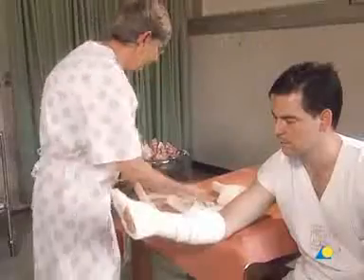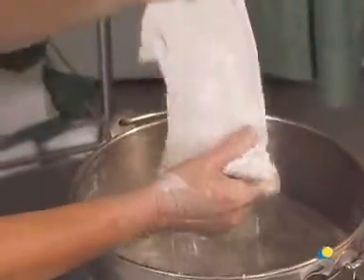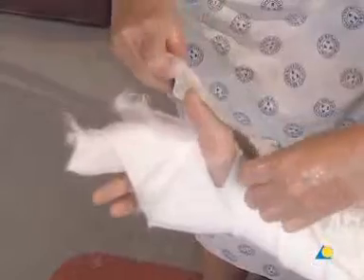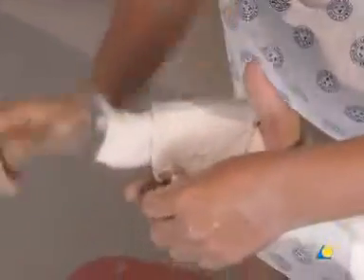The plaster slab is wetted by pulling it through the water. The excess water is removed. The slab is applied around the base of the thumb, the second finger, and radial side, forming a gutter or channel.